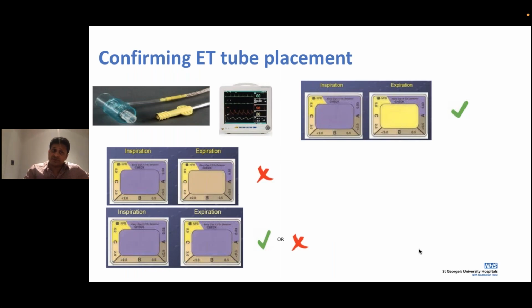After you've inserted it, we are really looking at whether the tube is in. There are a number of ways of making out where the tube is. The first one, which is commonly used, is the EtCO2 detector. There is an effective color change. Ensure it's the bright yellow color and not the pale yellow or the beige color, which does not mean that the ET tube is in.